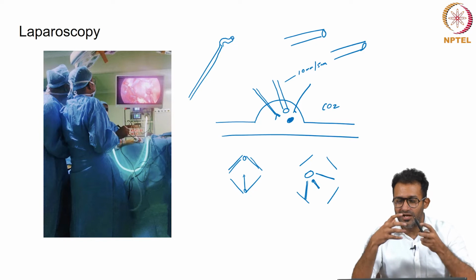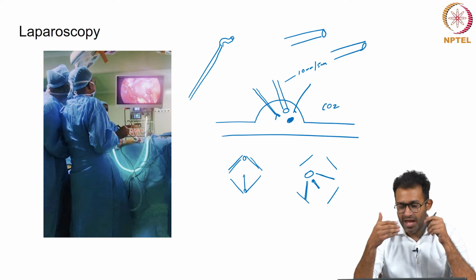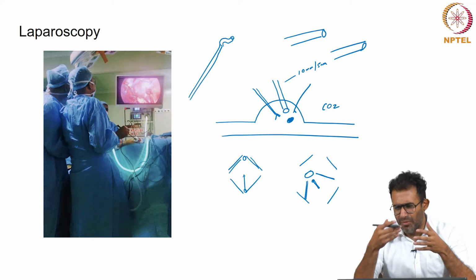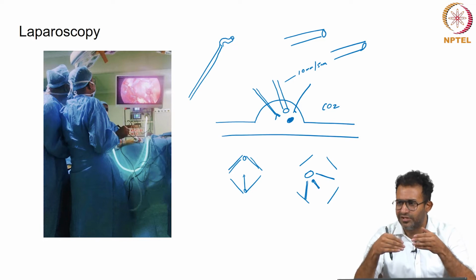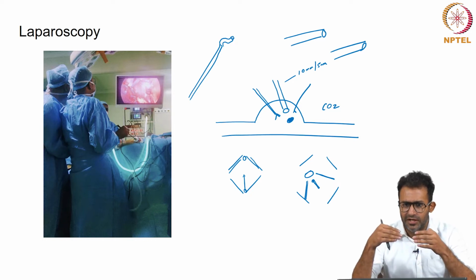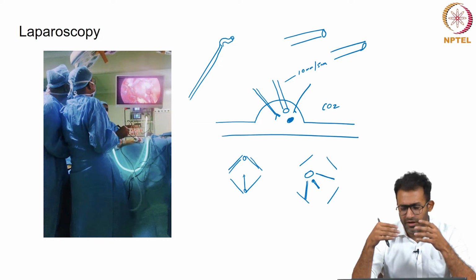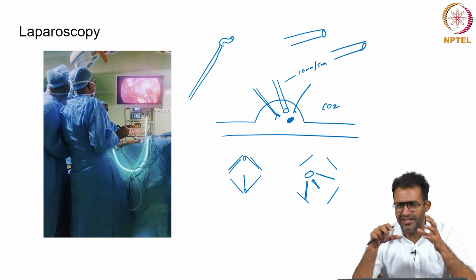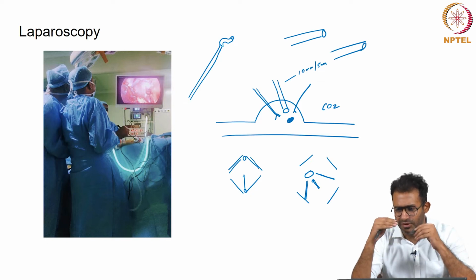It gives you a semi-tactile feel, and with recent advances in machine learning and artificial intelligence, the amount of haptic feedback those instruments are giving is also improving. So technology is moving towards minimal access surgery. I personally feel that minimal access surgery itself is a misnomer, because it's actually maximal access. The entry is small, but the access you get is quite maximal. So it's taking laparoscopic surgery towards newer frontiers.